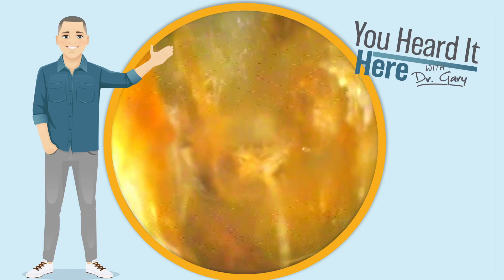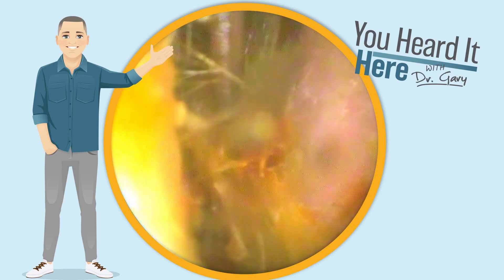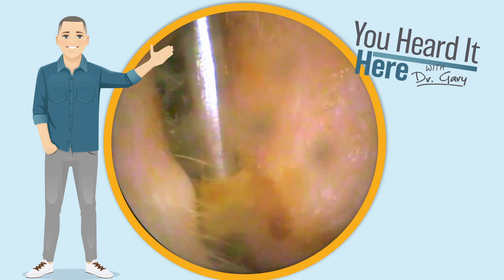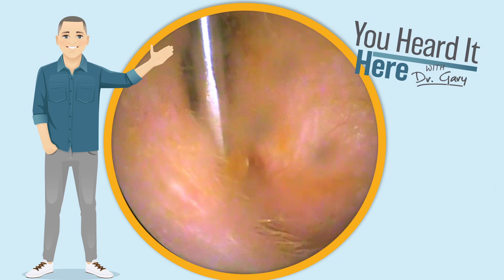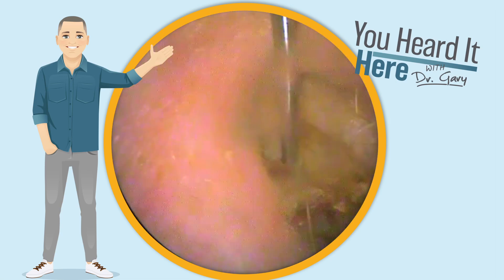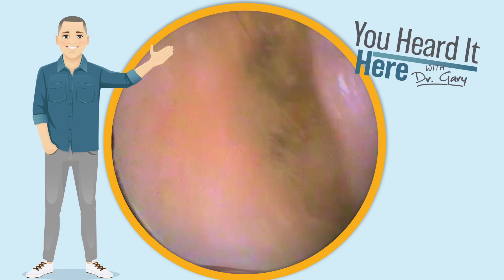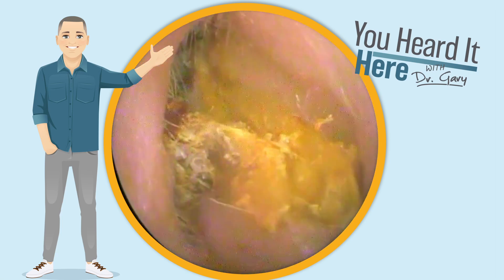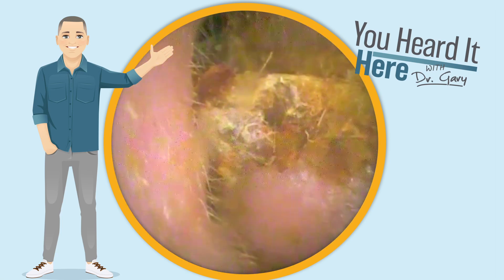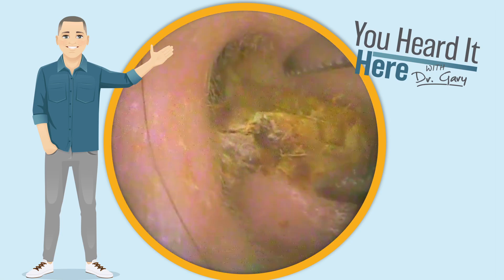In this patient's case, they only have a PE tube in one ear, but they do have a history of ear infections bilaterally. So we're going to go ahead and clean out this other side. As you can see, it's pretty impacted. We're using the curette to start the process and get it removed. This patient does tend to produce the type of wax that stays together almost like big skin ribbons, so we're going to use alligator forceps to help remove that big chunk of wax and see what it looks like back there.